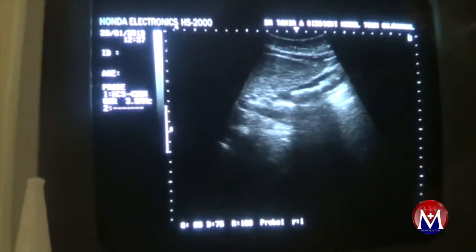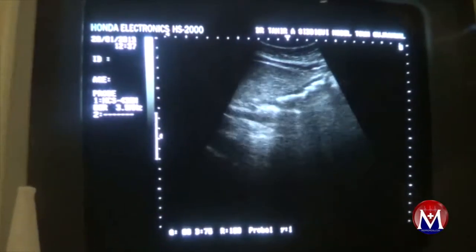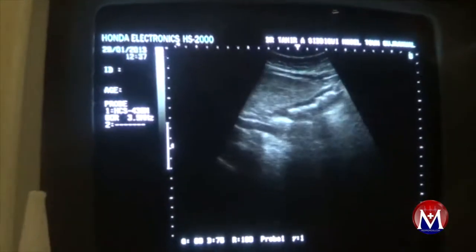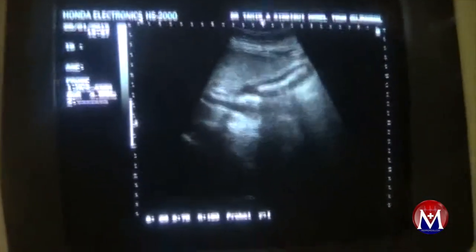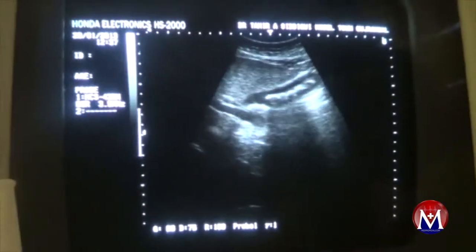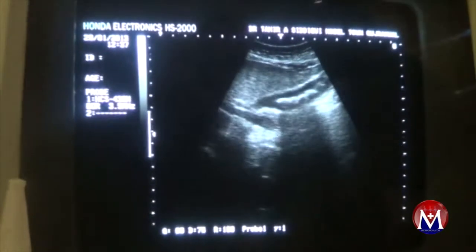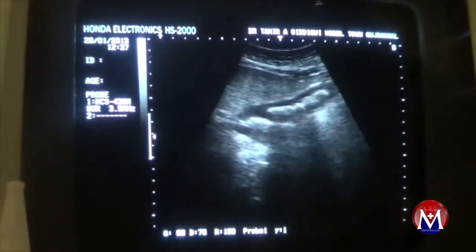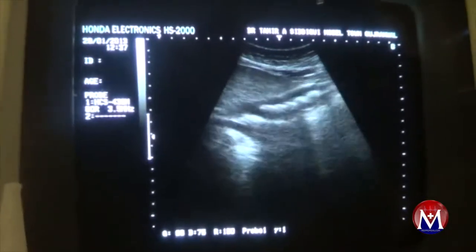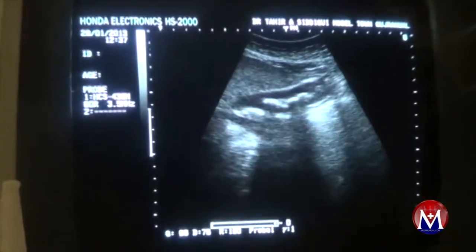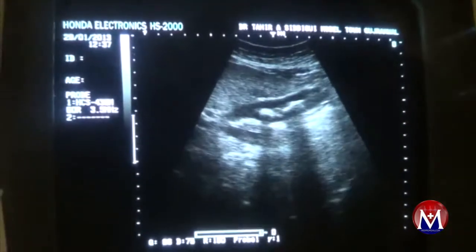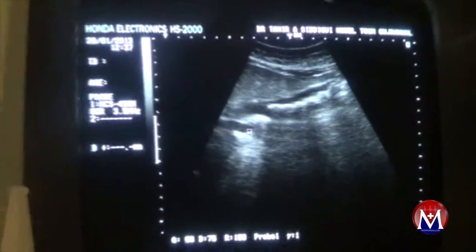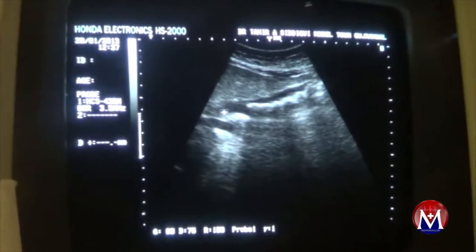This is an ultrasound study of a gallbladder with the patient in lateral decubitus position. We are seeing the longitudinal view of the gallbladder. We can confirm it is a gallbladder because we can see the portal vein at a right angle to the neck of the gallbladder.